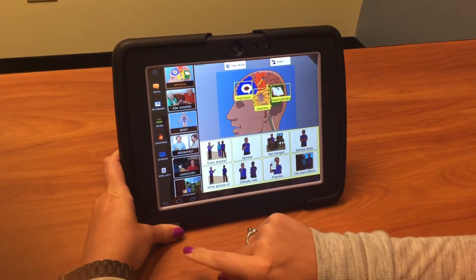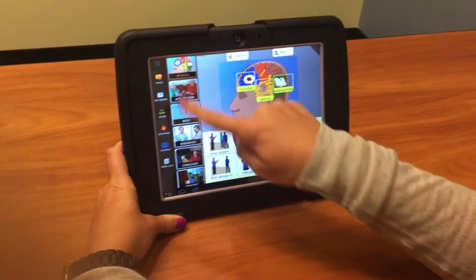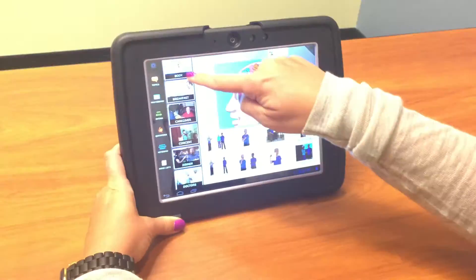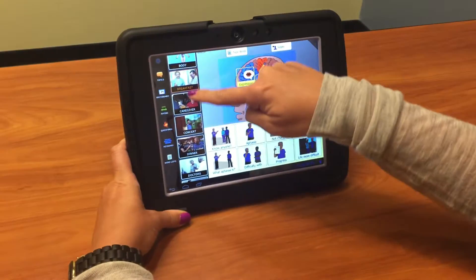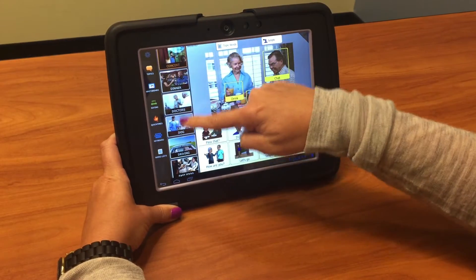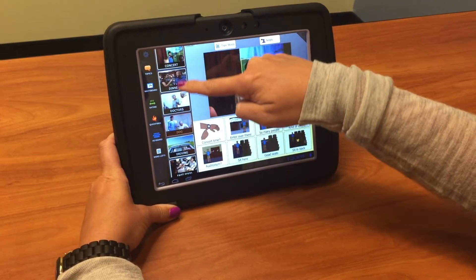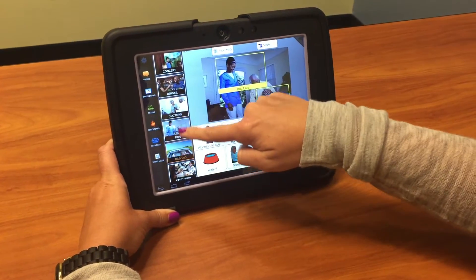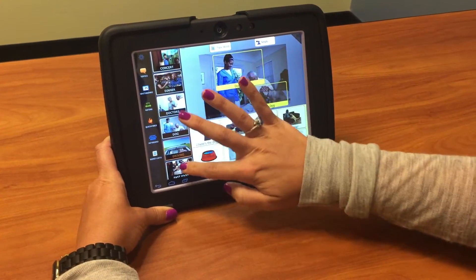First you have all the topics on the side here: Dinner, concert, dogs, family.